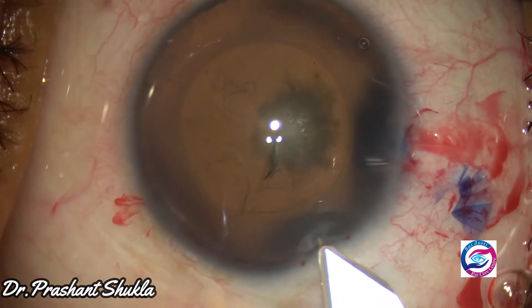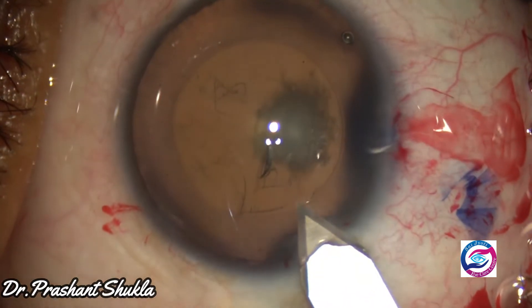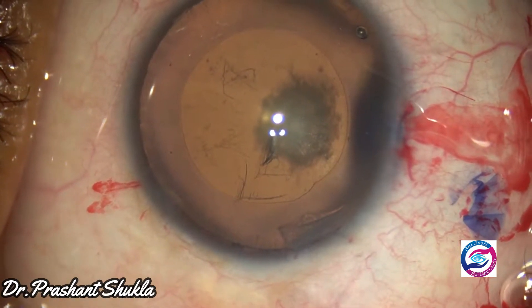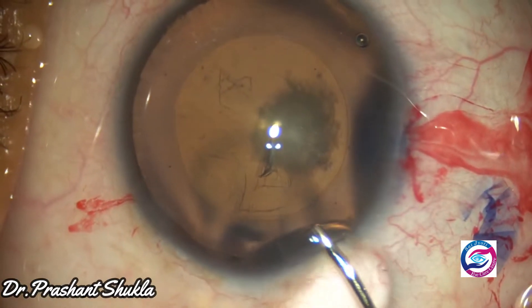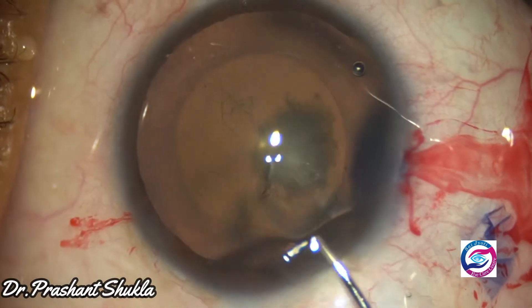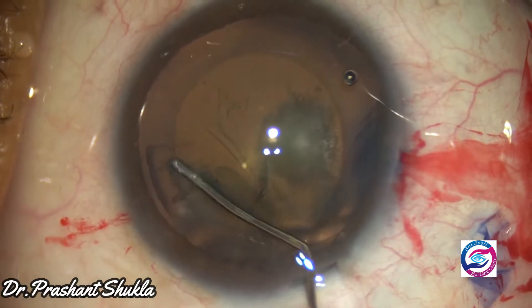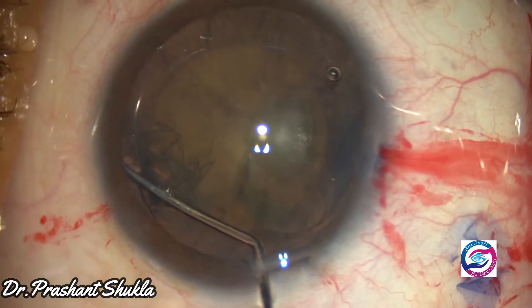A 2.8mm three-planed main port is made using a steel keratome. Hydrodissection is one of the key steps when we are dealing with soft posterior subcapsular cataracts.